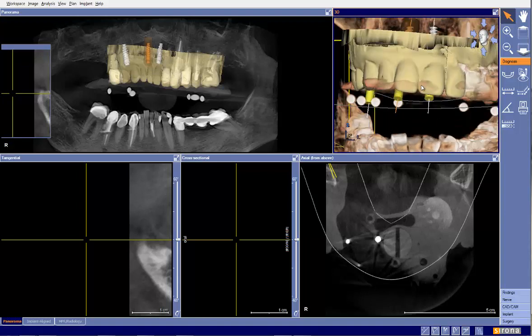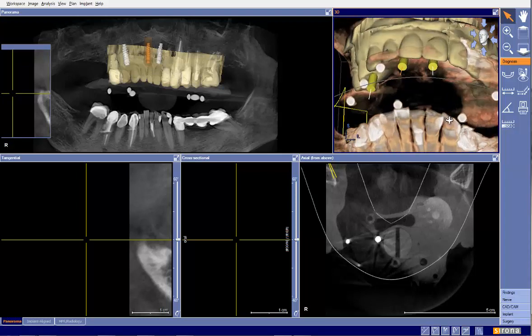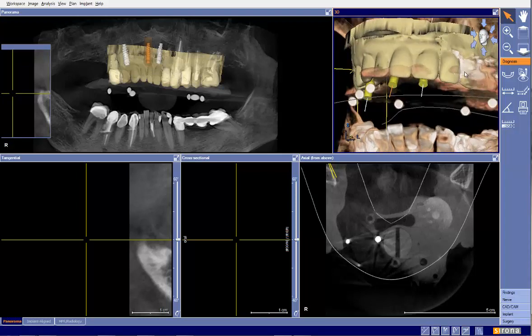Okay, we've been sent an interesting case today. It's the first one that's been submitted like this, and it's a good opportunity to talk about a few different options. This particular patient was submitted with the following notes.